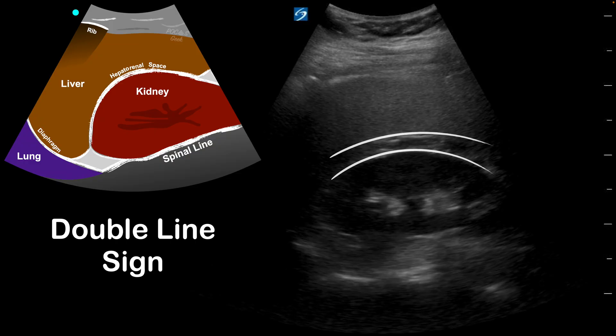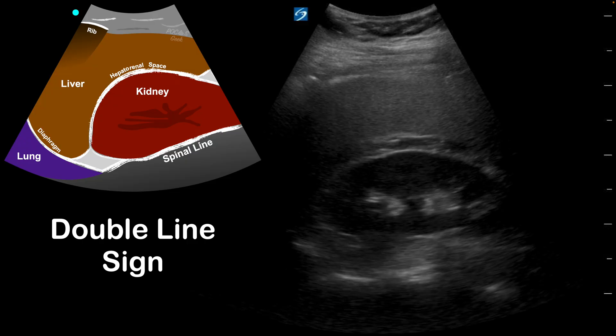The double line sign occurs when there is perinephric fat — fat between the liver and the kidney, whether it's inside the kidney capsule or outside. We get these two lines because between liver and fat there's a big difference in acoustic impedance, and then between fat and the kidney there's also a big difference. As the ultrasound beam travels through that area, there's a big reflection back to the probe, creating a hyperechoic bright line. That is what causes this double line sign, and it is an easy way to get a false positive exam.